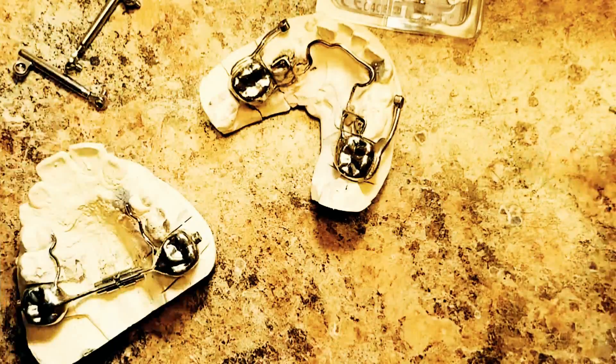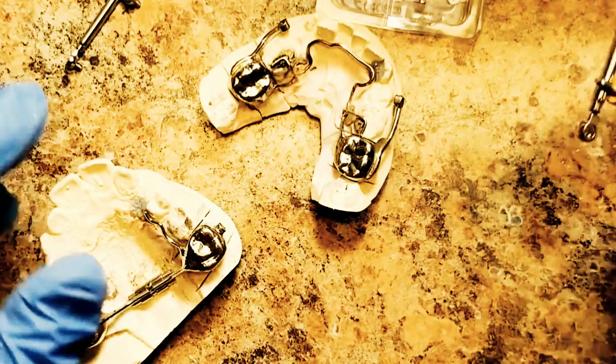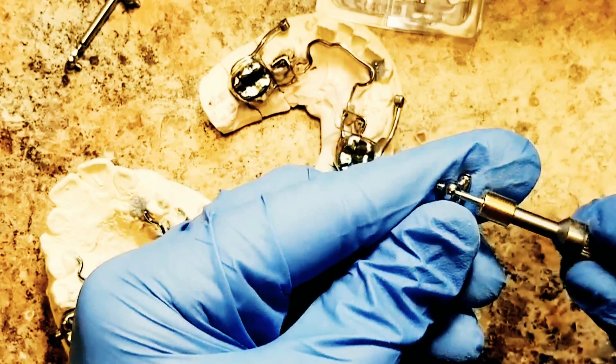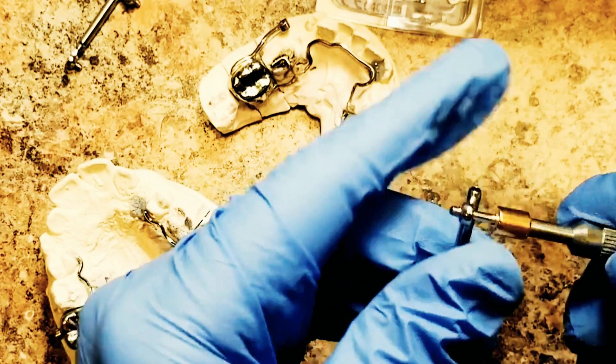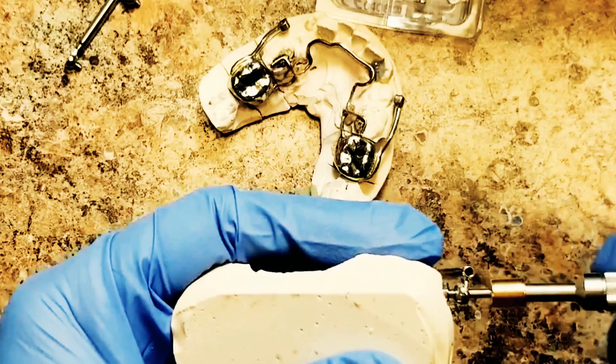So again, this time I'm going to assemble this Herbst — pretty straightforward.